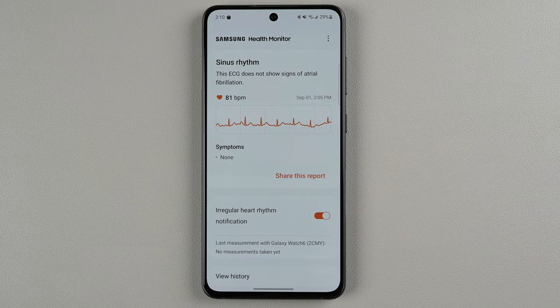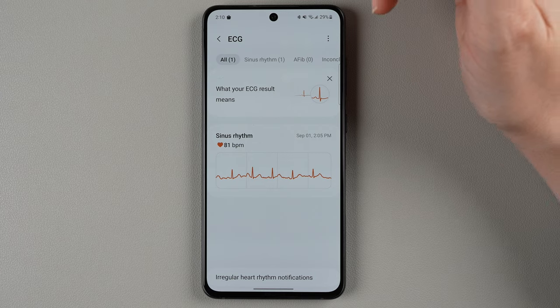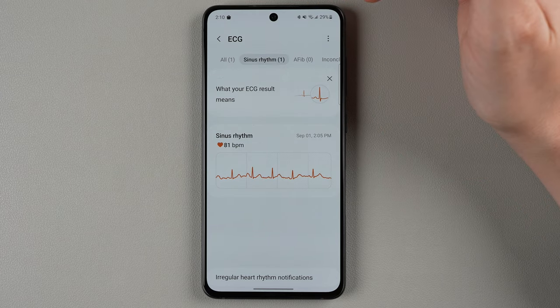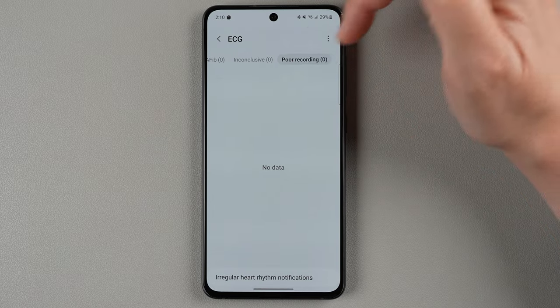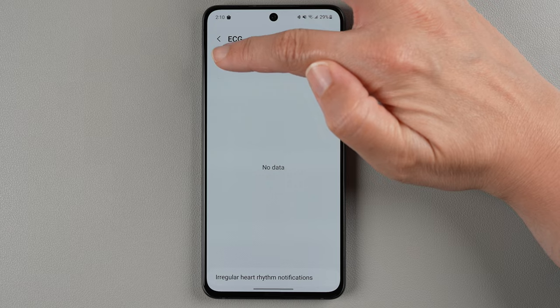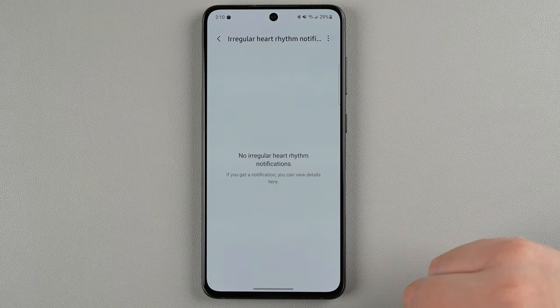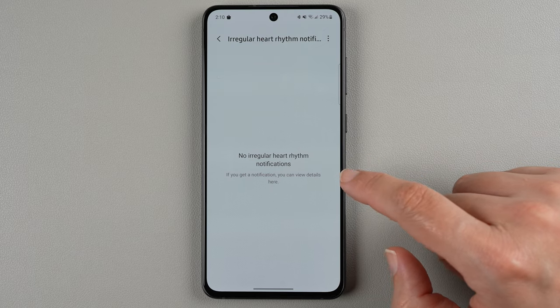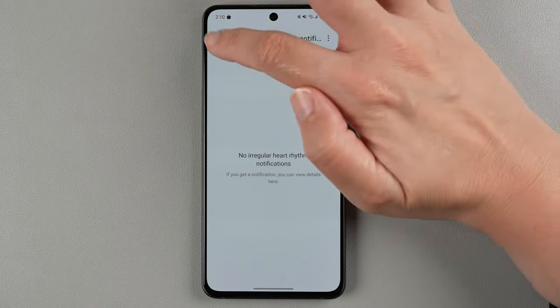If I tap view history, we have all notifications. You can look at only your sinus rhythm results, only your AFib results, or only your inconclusive or poor recording results. And then irregular heart rhythm notifications — we can tap there. I did not have any yet, but if you ever get one, you can view the details there. So that's helpful to know.